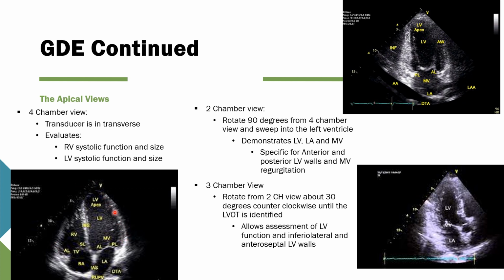You can assess and see the muscle and evaluate if it's all contracting or if some parts are being dragged along. So it's still a really good view, even if you don't have the software package that might give you those specific details of ejection fraction.